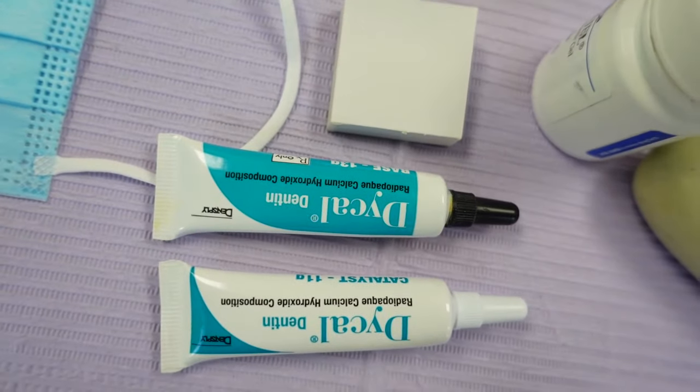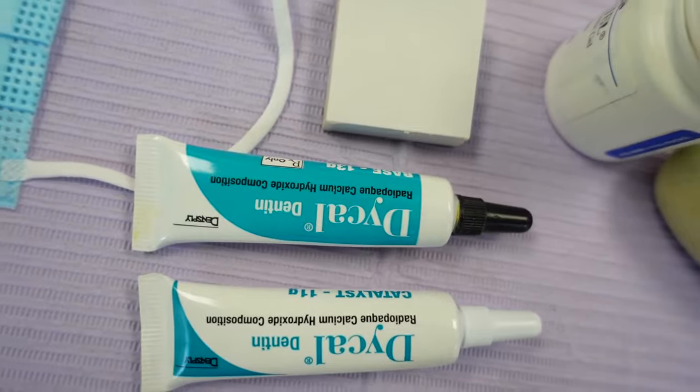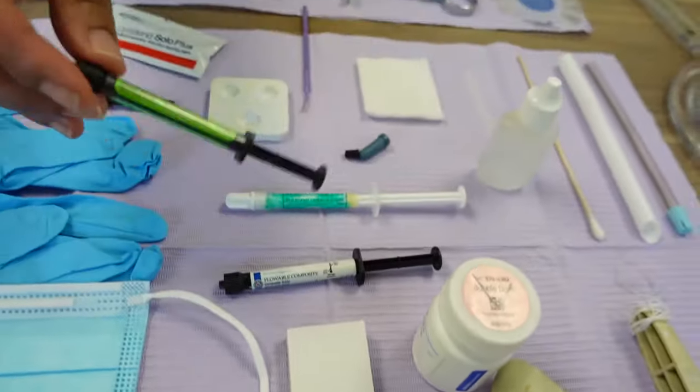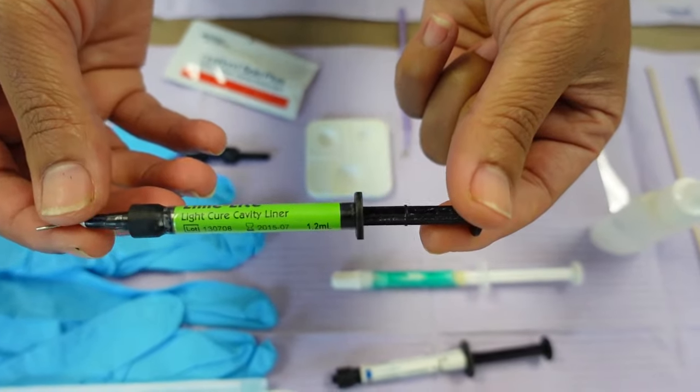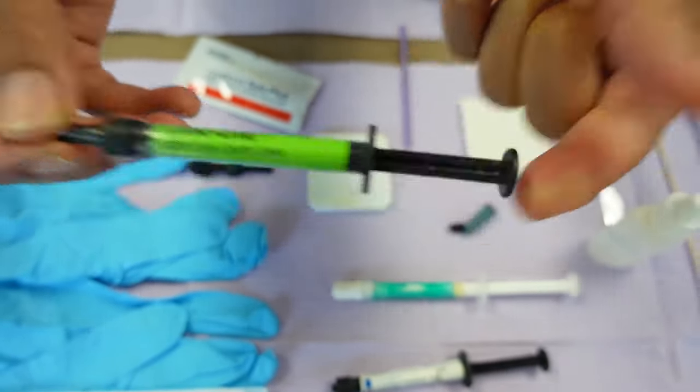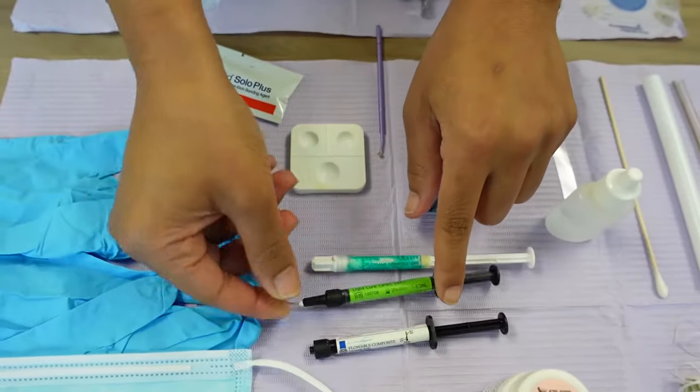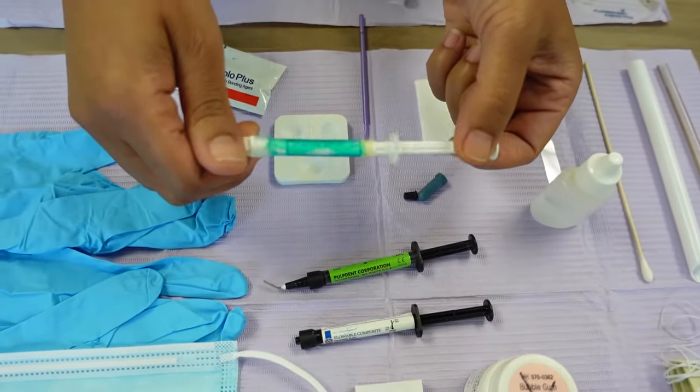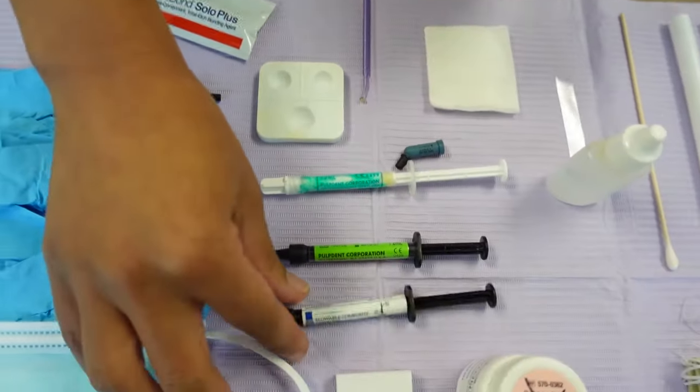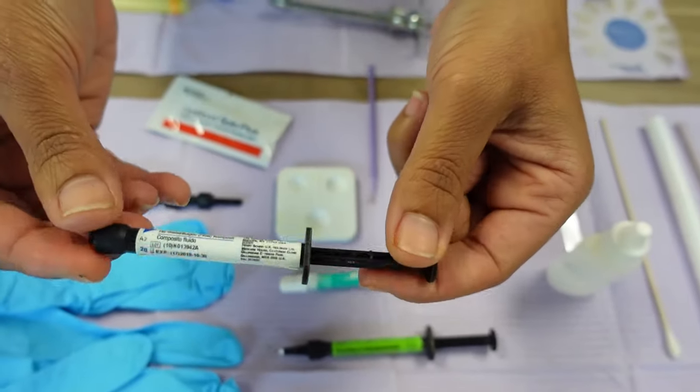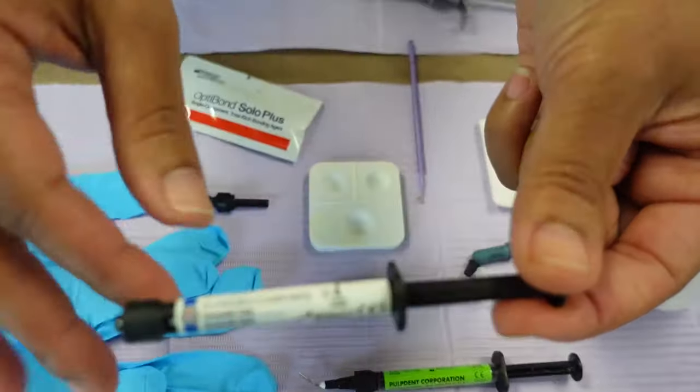We also have Lime Lite—this has become very popular. The doctor likes to use this as a cavity liner versus the Dical, but it depends on the doctor you're working for. This is a sample etch because that's always used before anything else. Flowable is used particularly sometimes—doctors like to use that just to line it a little bit before they actually put the real composite on top of the tooth.